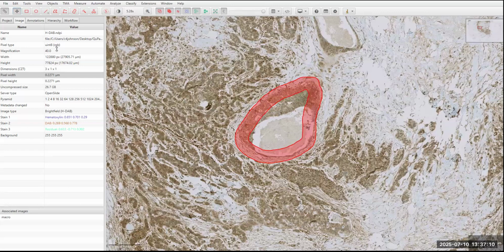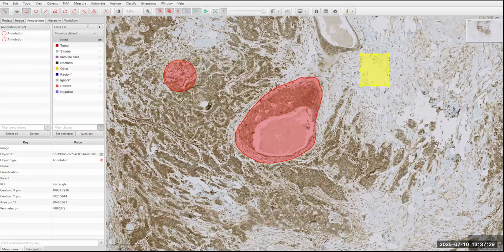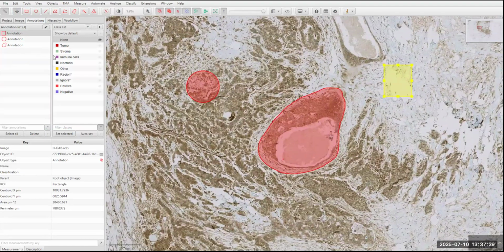All right. We have to select the annotation here. So your annotation list will store all of your annotations. And then I think I can then, yeah, you can paint within the annotation. So any new annotations that I build are automatically going to be added to the annotation list, unlike the ROI manager in Fiji, where you have to manually do it. Every single one is just added automatically.